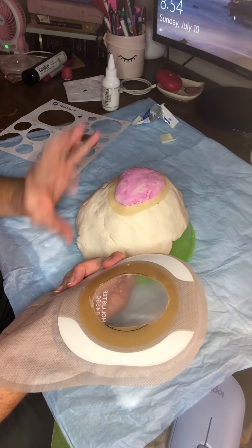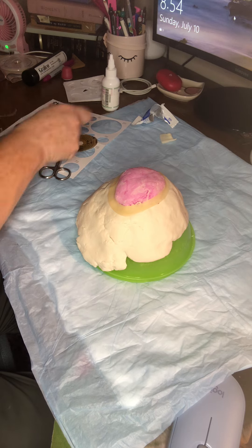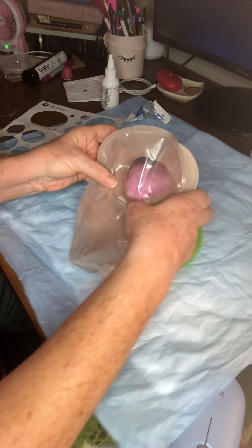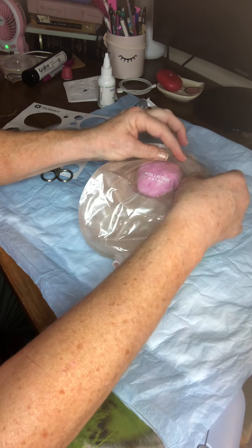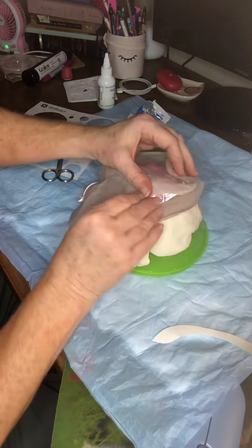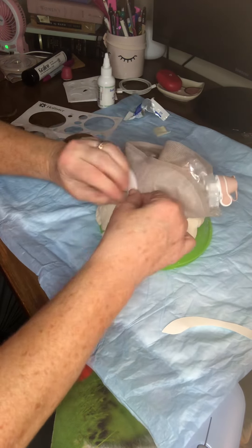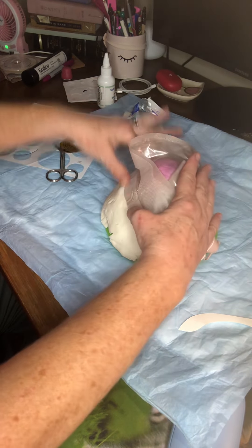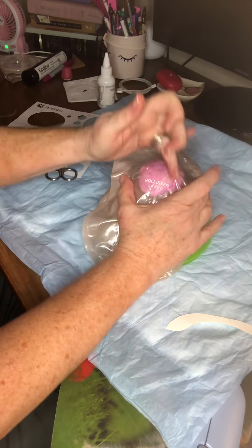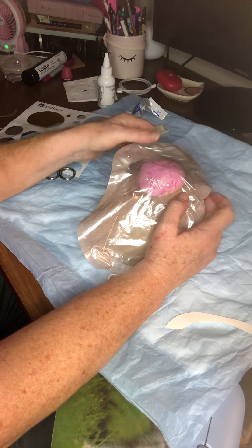That will help get these hypergranulated areas and irritated skin to dry up. The easiest way to put the pouch on when you have a hernia is to stand in front of a mirror — that's probably the best way. If you're sitting down, grab this edge, kind of see through here, pull it on through, and then pull it tight all around. You're going to form it around that hernia. Hold it with a warm hand so it really gets on there good. The stoma is just exposed and you've got all that irritated skin covered by the crusting and the barrier ring.